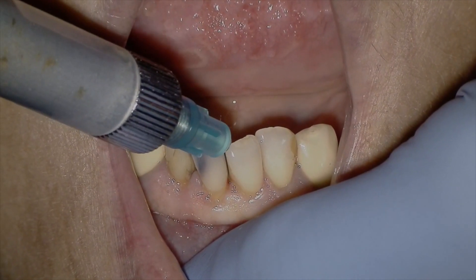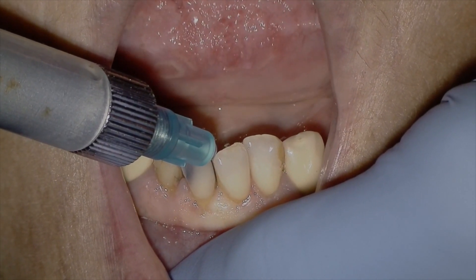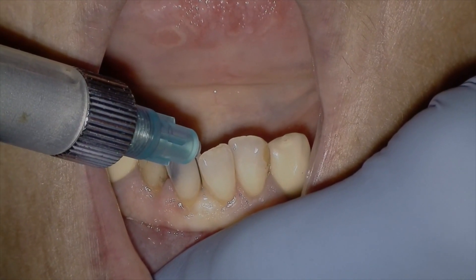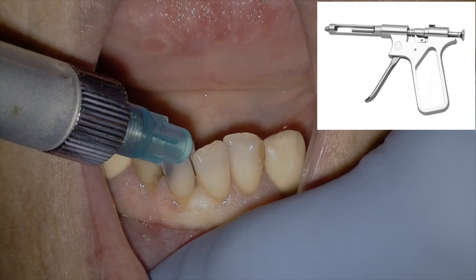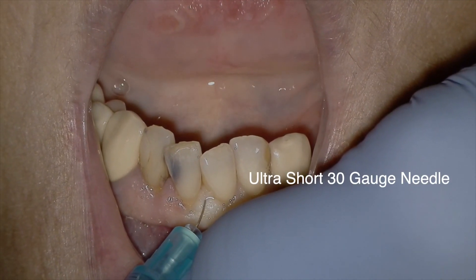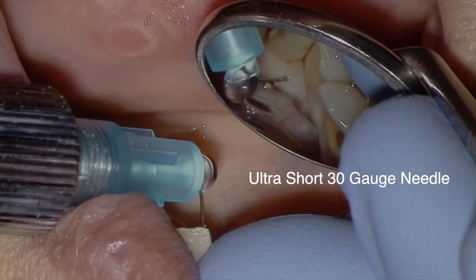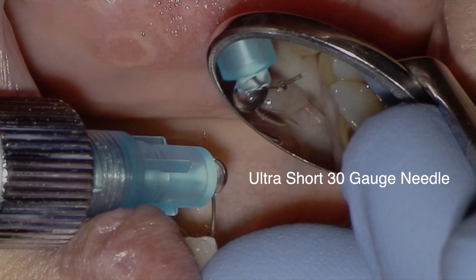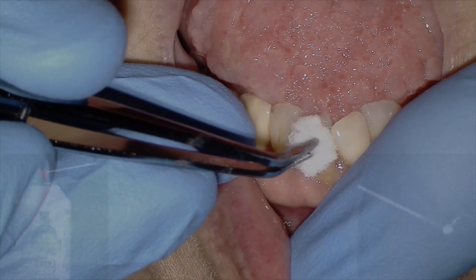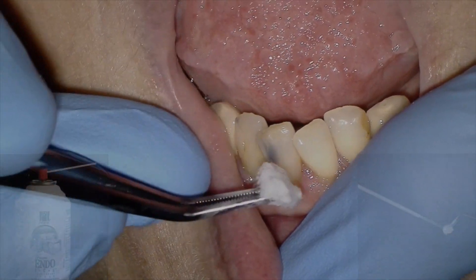Rather than a nerve block for this case, I elected to use a buccal infiltration and supplement of the PDL injection and lingual injection. She doesn't have any posterior teeth on the mandibular right and left, so my reference points are gone. After buccal infiltration, I use the ligament jet to inject down the PDL. I also inject in the papilla — this is how I do my lingual injections. Then I'll check with a cold test again after anesthesia to make sure she doesn't feel anything during the procedure.